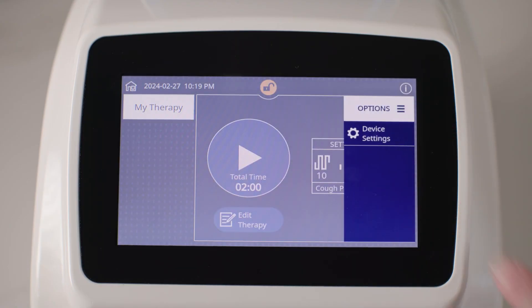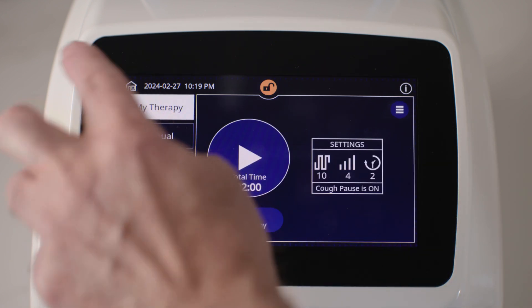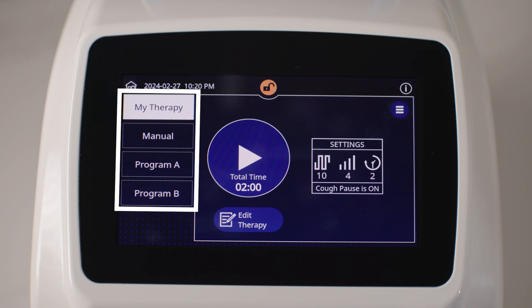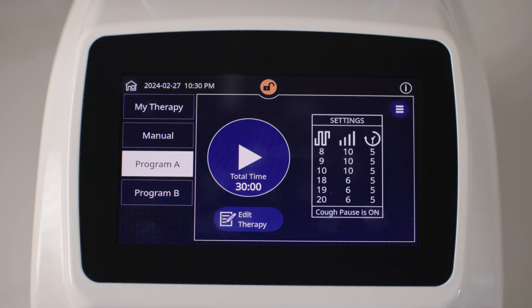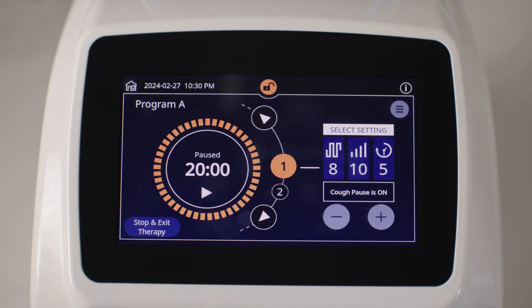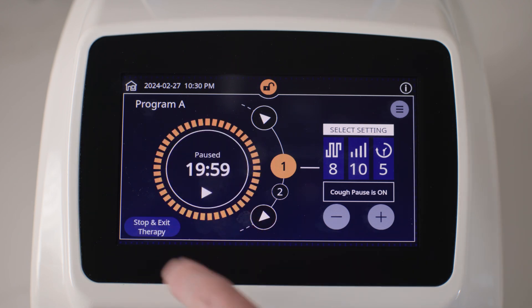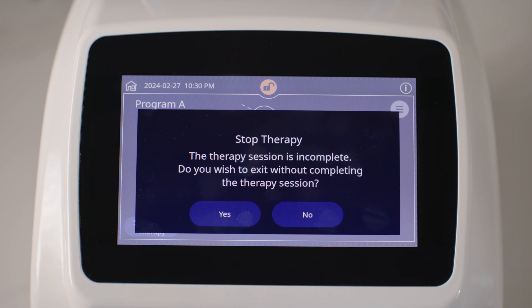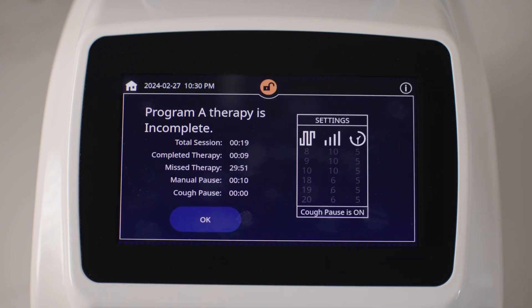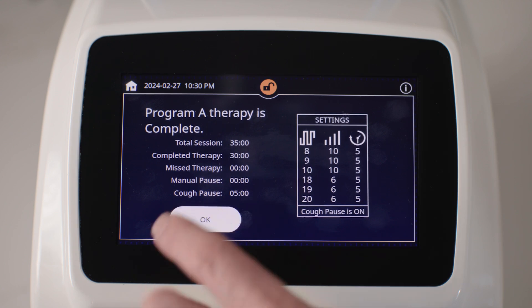Make sure that the device is in Advanced mode before completing the steps in this section. The screen will show other therapy programs in addition to My Therapy when in Advanced mode. See the Vest APX system instructions for use for information about enabling or disabling Advanced mode. To begin your therapy in Advanced mode, first tap the preferred program on the home screen, then tap the Start control on the display. To pause the therapy, tap the Pause control. To resume, tap the Start control again. To stop and exit the therapy, tap the Stop and Exit therapy control. A prompt asking if you would like to stop therapy appears — tap Yes to confirm, otherwise tap No to cancel. When therapy is complete, a summary screen appears. Tap OK to exit to return to the home screen.